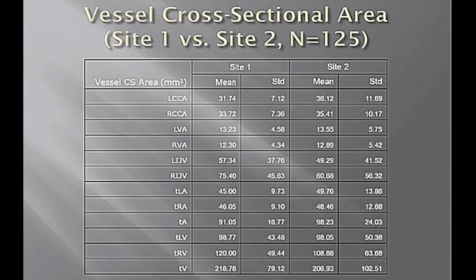Now, as Robert pointed out, these diameters vary all over the place. So rather than calling this a percent stenosis, although in a paper we hope that will be accepted shortly, we used 67% stenosis that in this case was based on a 1 centimeter diameter as the correct value.